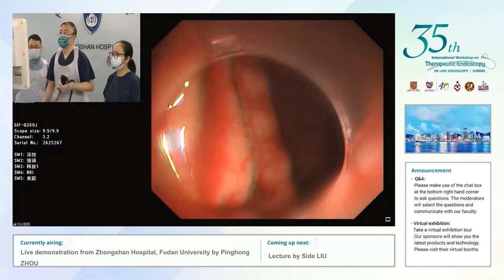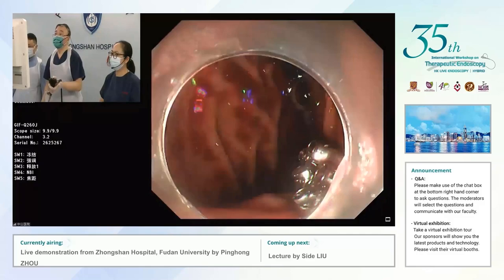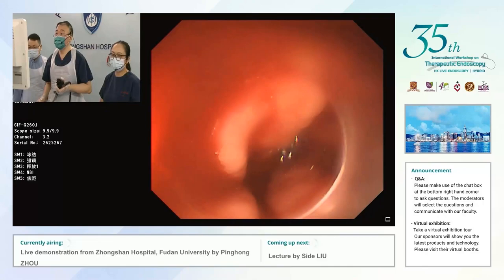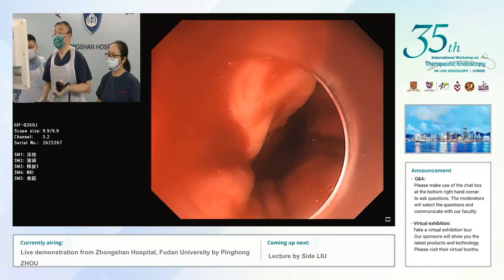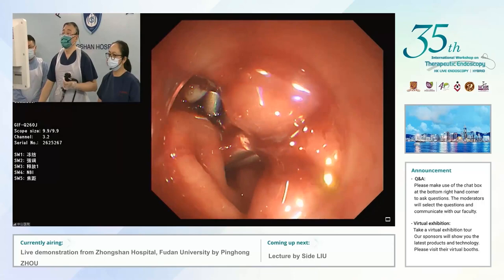How do you plan to remove the tumor, Professor Zhao? Maybe this lesion is a GIST. Before removal of the whole lesion, I first close the wound. Next I want to use the basket to remove the lesion. If it's impossible in one block, I will cut it into two, three, or four pieces. Professor Zhao, that was a fantastic demonstration — thank you very much. Wonderful demonstration.